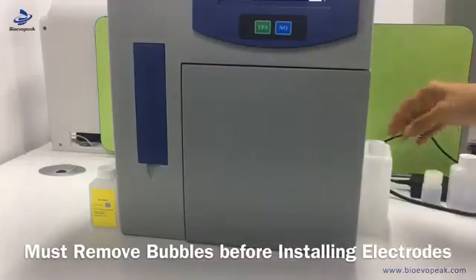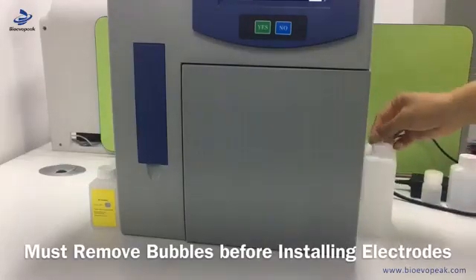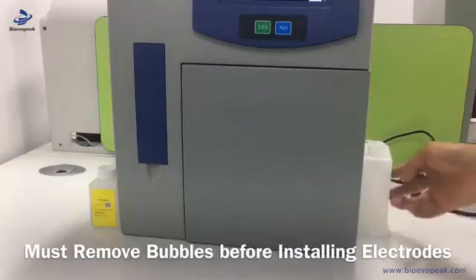As we can see, the waste tube is outside. We put a container here to collect the waste solutions.